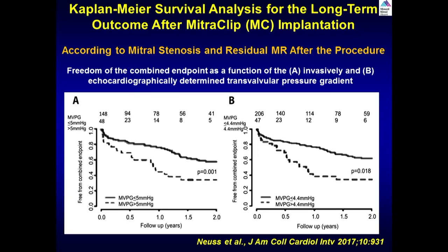For the first clip, as long as we know we are at 5, anything more than 5, we would not go with the second clip. If we know you are at 5 already with the first clip and you do a second, we'll be at 7 or more. Yeah. So you didn't want to get into that. That's a rule we have had here.